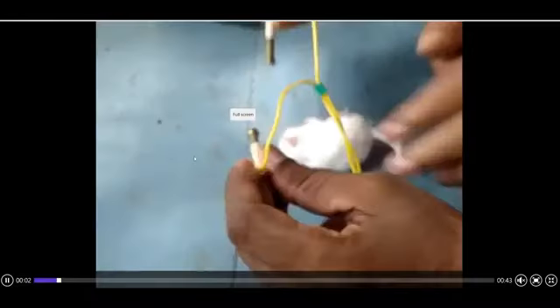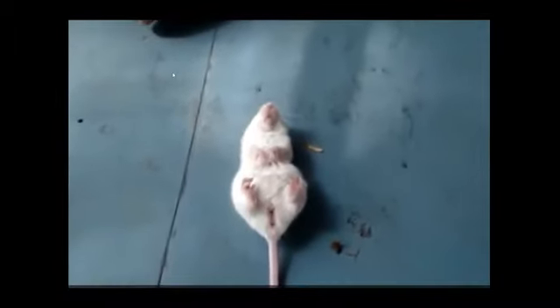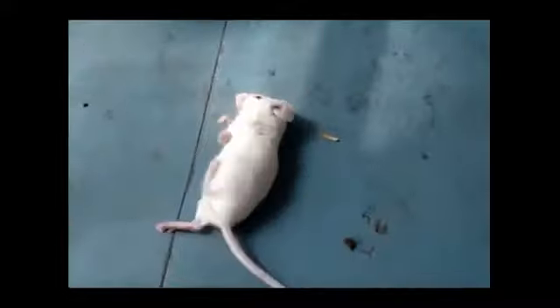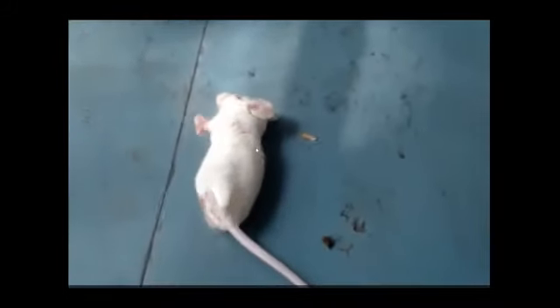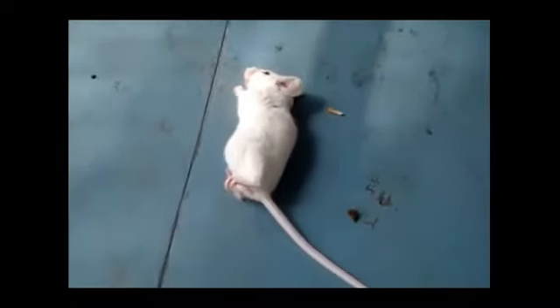Now I am going to take a drug treated animal. The drug I have used is PHENYTOIN. The electric shock has been provided. Now you can see a rapid shiver, and the time is very less, only about 3 seconds, and jerking is also only 5 to 6 seconds.